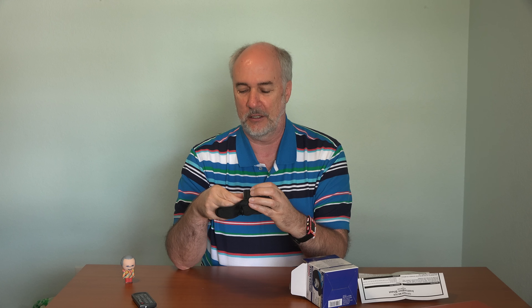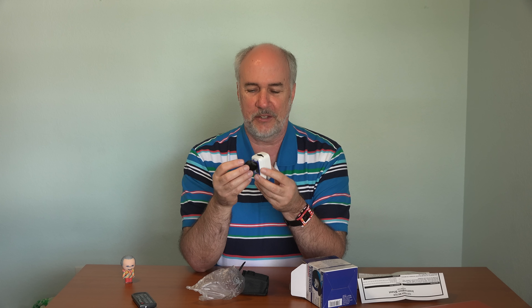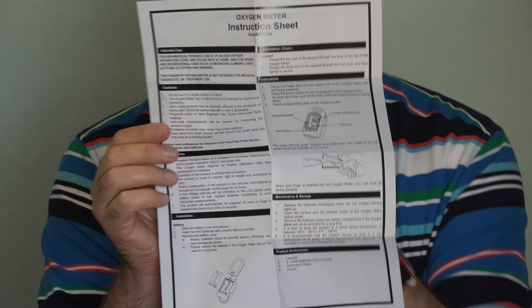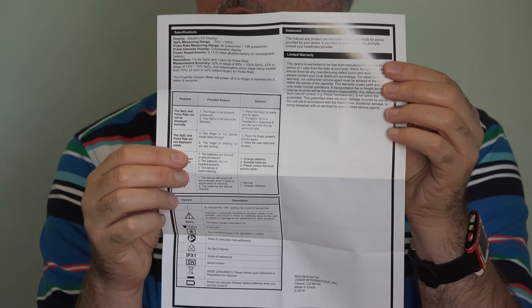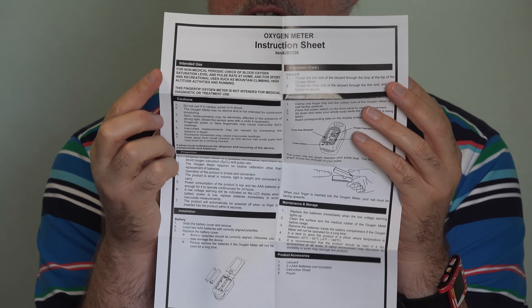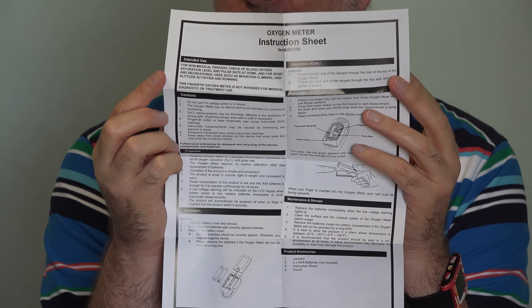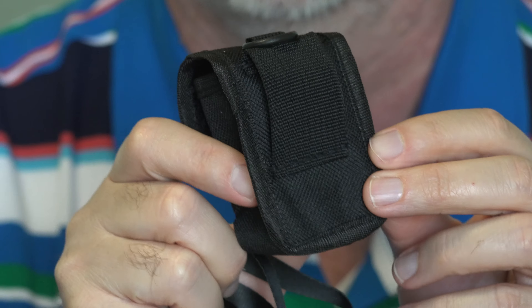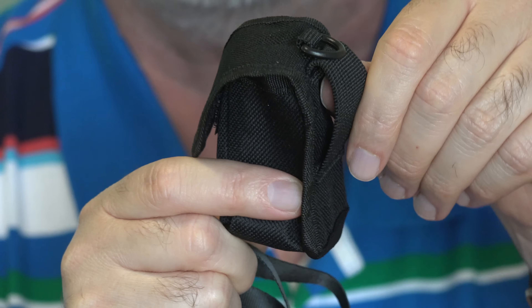We have the instruction page. It comes with a carrying case. This is useful outside of your home as well. Here is the device with a strap in case you want to wear it around your neck. Here's the instruction sheet — it's very simple to use, but if you're having issues you may need troubleshooting. Up in the corner, it does tell you this is not for medical diagnostic or treatment use. The carrying case and the lanyard are included. If you're going to carry it with you, it can fit right onto your belt.